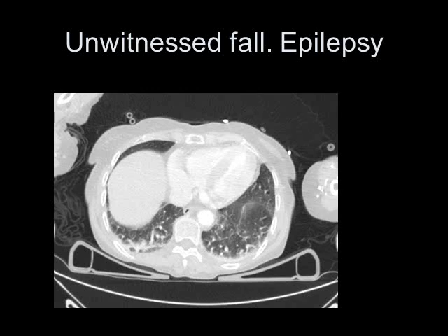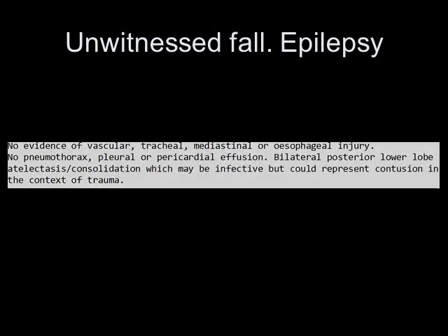An unwitnessed fall in a patient with epilepsy — we're not expecting there to be significant force in the fall; it was presumably a fall from standing. The pattern of density here I would certainly call atelectatic change. Here's the report on this patient: bilateral posterior lower lobe atelectasis/consolidation, which may be infective but could represent contusion in the context of trauma.